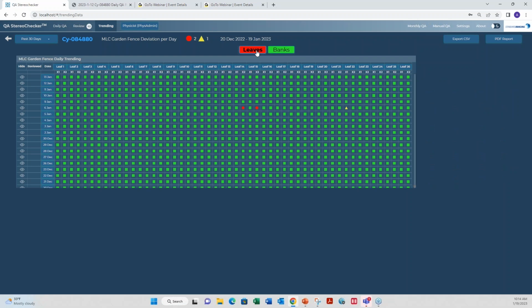So it was our leaves that caused consternation. And I know this is a busy looking screen, but all those things that passed when they're empty, it left a couple people going, did I actually do my QA? So we want absolutely no question. Your QA was performed. Where did I have an alert or where did I have an error?